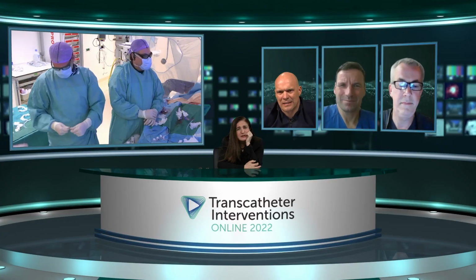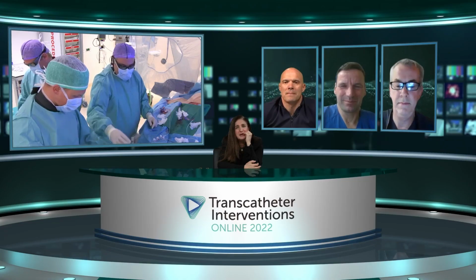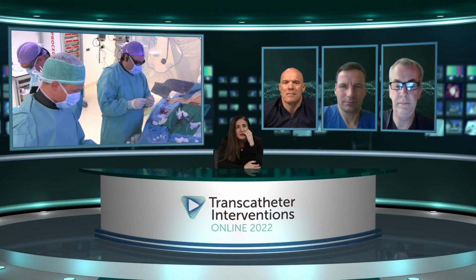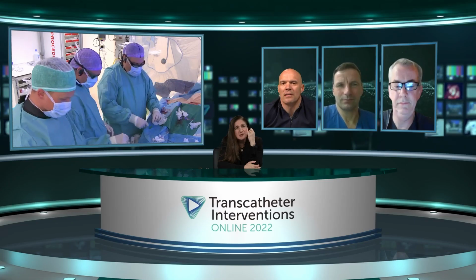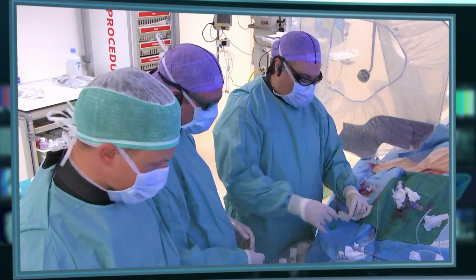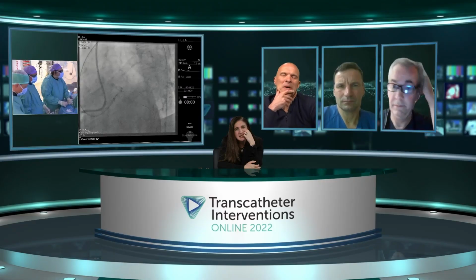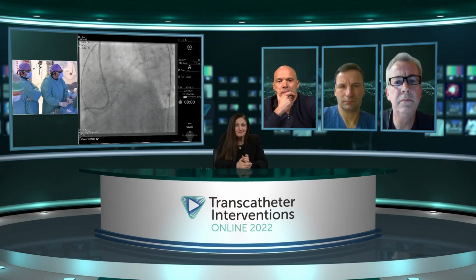And I'm wondering, instead of such a stiff wire, to think about a Whisper or some kind of Pilot just to get through. I don't know, what do you think? Well, I'm thinking the stiff wire is not to go through, but just to get the dissection, and then to go through with the knuckle. That was in my mind. I would maybe try with a Pilot 200 to get in the right direction, dissect there, and then exchange.